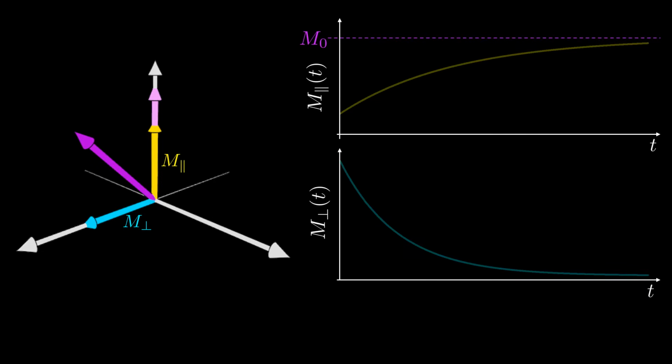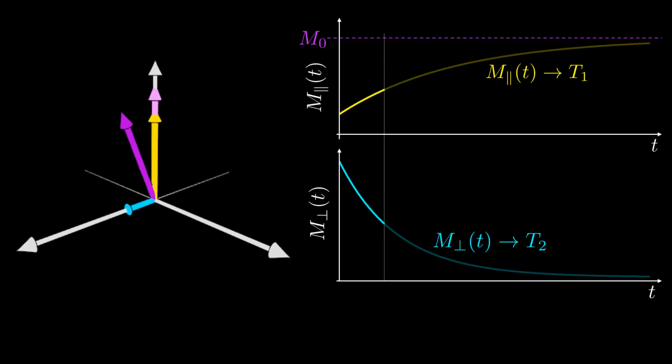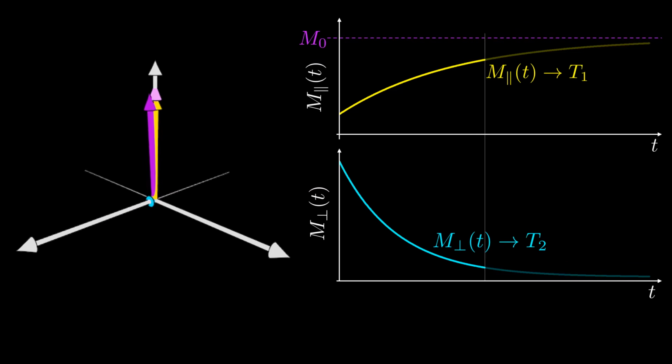Any NMR experiment essentially involves knocking our sample's magnetization out of equilibrium, whereupon it delivers detectable signal as it returns to Boltzmann equilibrium, the signal we detect and analyze. So here I'm illustrating an NMR experiment where we might knock the nuclear magnetism out of alignment with the B0 field by a flip angle theta. The key to understanding NMR dynamics is that our magnetization vector will return to Boltzmann following the relaxation principles we discussed in the last video.